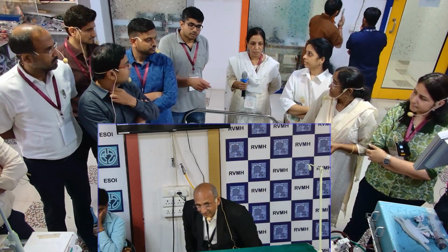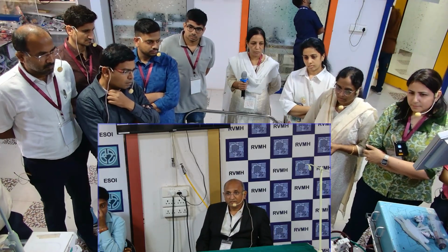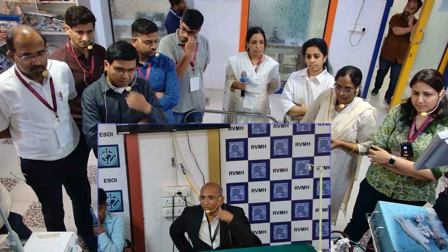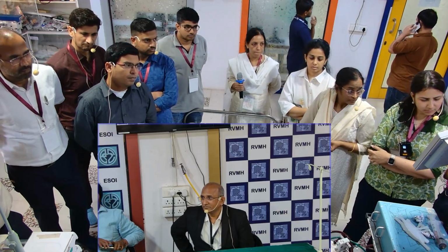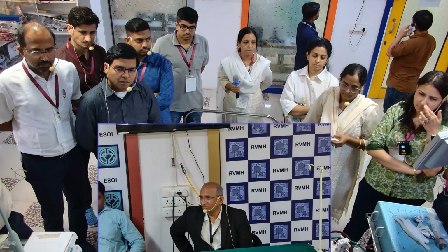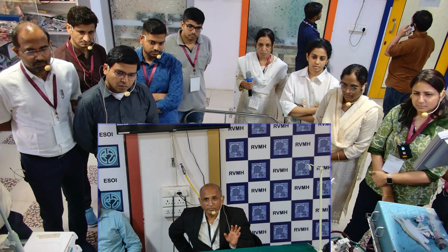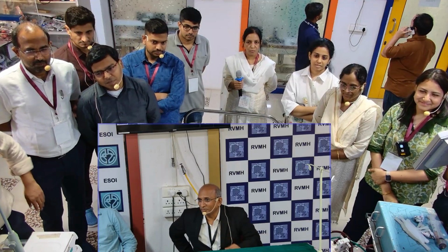Can I connect the oxygen pipe directly without the HME filter? Yes, we can connect it temporarily without the HME filter. The HME filter is only to prevent water molecules from going inside, that's it. How frequently should we change the HME filter? There is no hard and fast rule, but whenever you have some suspicion like this. Perfusionists would think first about the HME filter getting blocked.